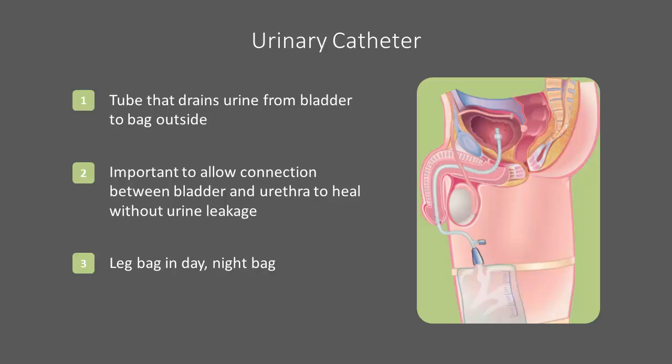There are 2 types of drainage bags for the catheter. You will likely wear a small bag strapped to your leg in the day, and a larger bag at the side of the bed at night. Catheter care is discussed in detail in a separate module.